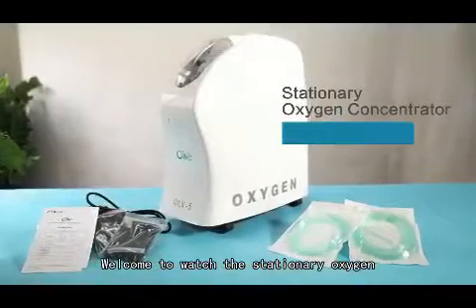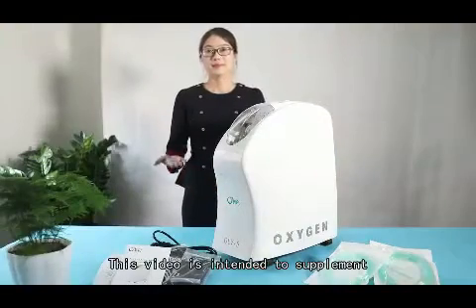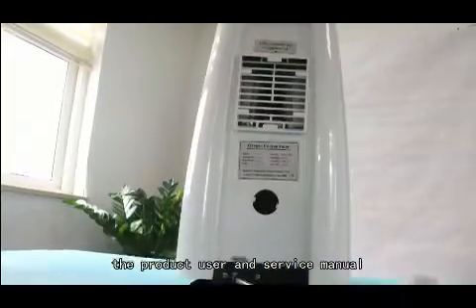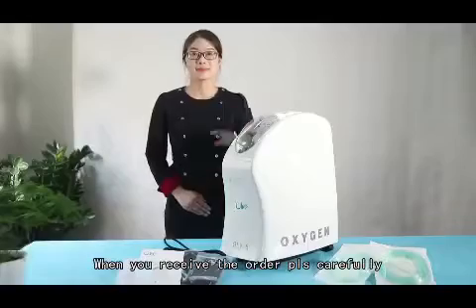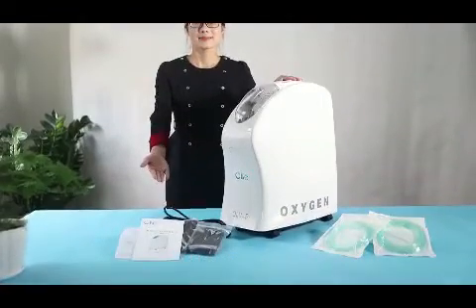Welcome to watch the Stationary Oxygen Concentrator Training Video. This video is intended to supplement the product user and service manual. When you receive the order, please carefully remove all the contents of the box.